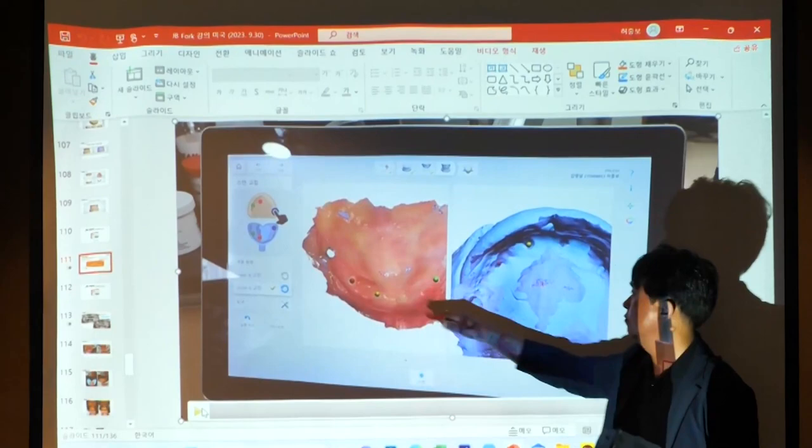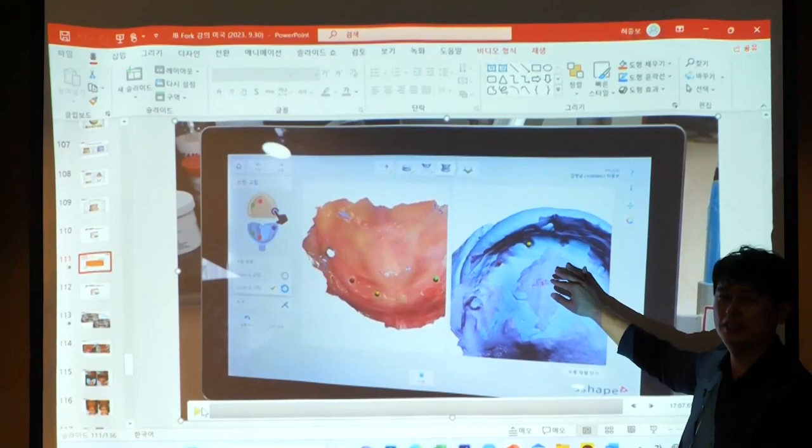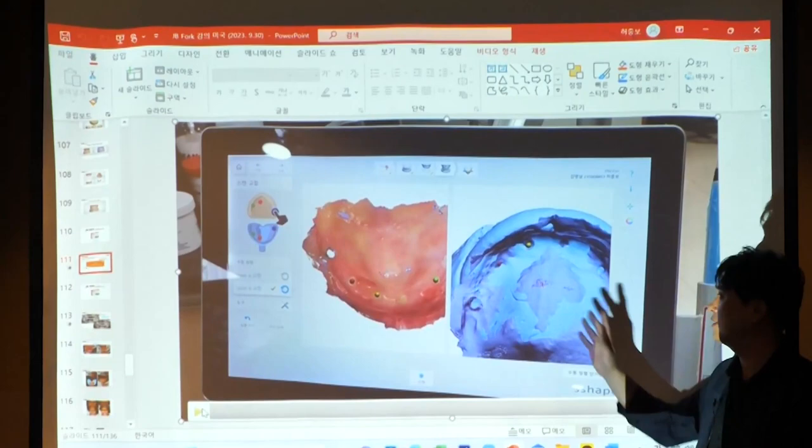This data is merged together. The 3Shape software gives us very convenient tools for merging. After that, you can send this one file to the dental lab by email, and next time you can get the temporary denture.